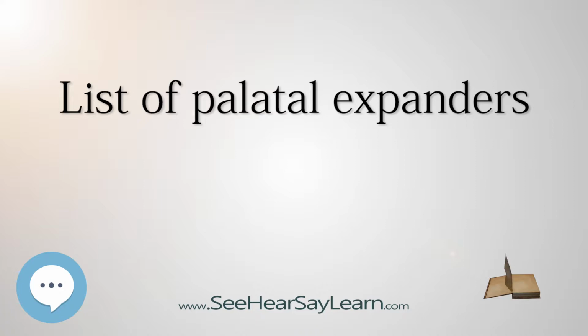Tissue-supported expanders allow the forces to be applied directly to the tissues of palatal mucosa instead of teeth. The most common type of tissue-borne expander is known as the Haas appliance. This appliance was popularized by Andrew Haas in 1961. This appliance involves bands placed on maxillary first premolar and first molars on each side.